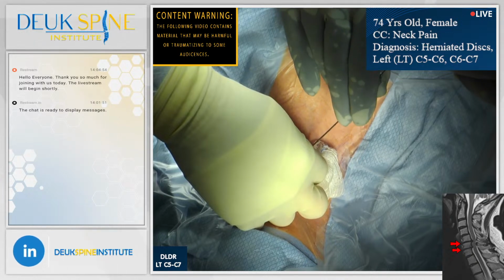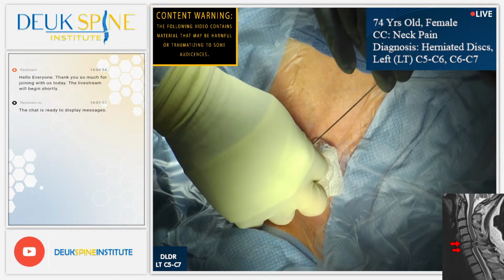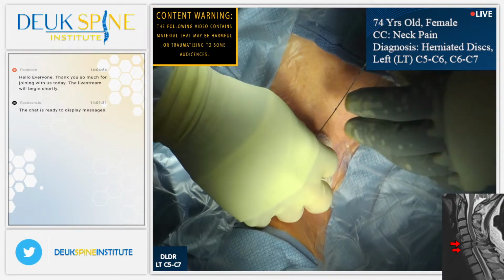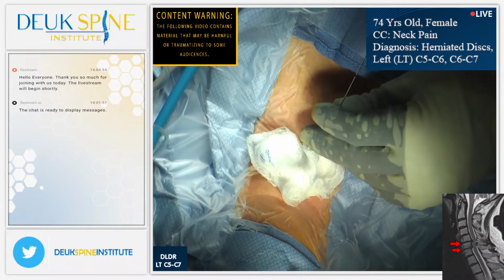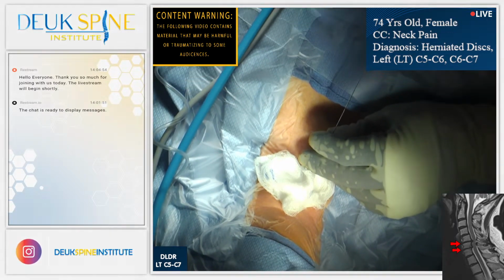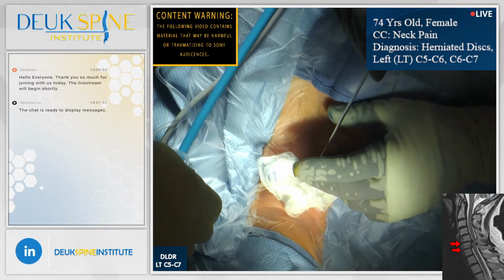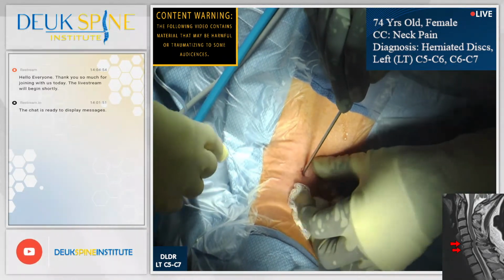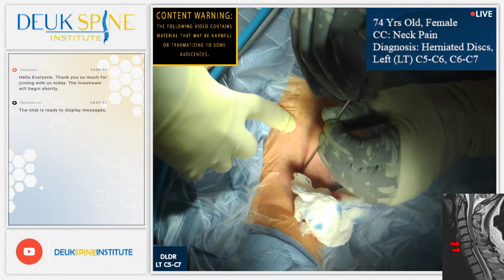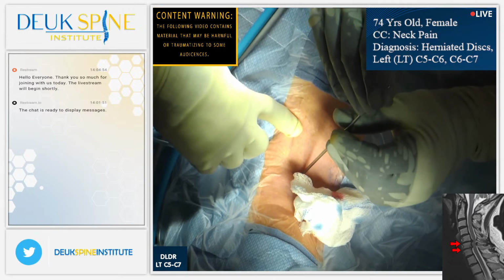Okay, removing the needle on our first disc. Our first patient today was a lady from Singapore. We did 2 cervical discs, just like we are now, plus we did a Deuk plasma rhizotomy for facet pain. Just did it all in one procedure. She already went home. She is doing fantastic. And our other case was a lumbar Deuk plasma rhizotomy and ischial tuberosity injection for a hamstring pull. Patient had ripped their hamstring off their ischial tuberosity.